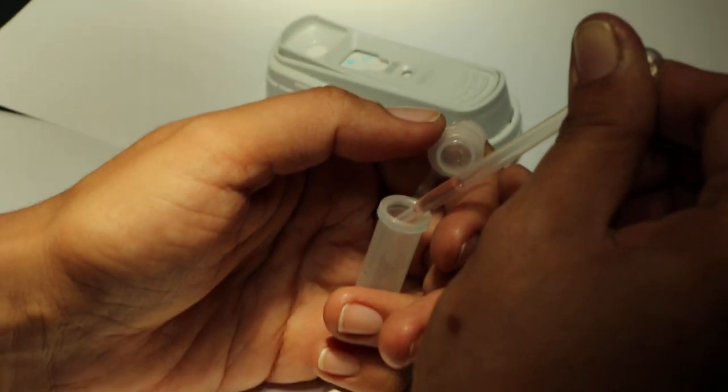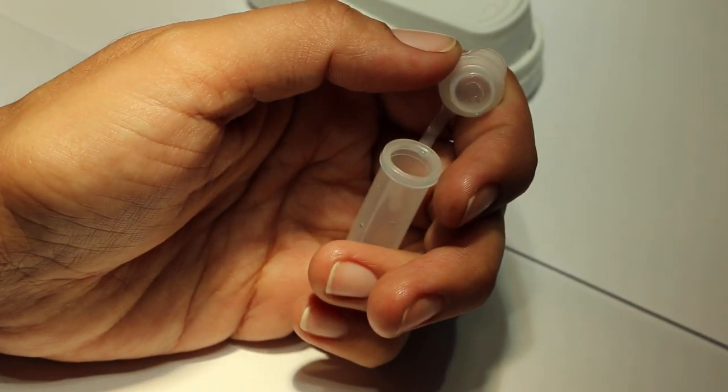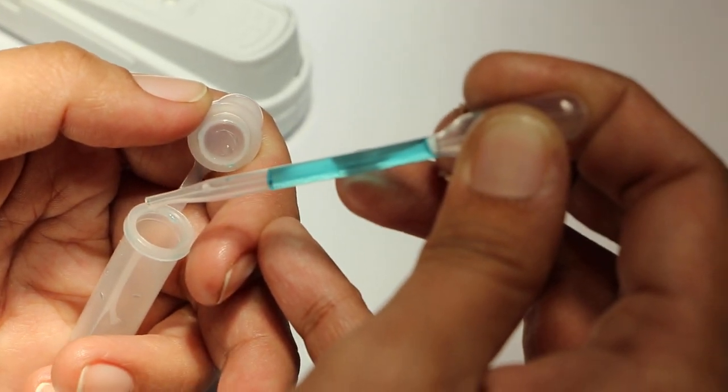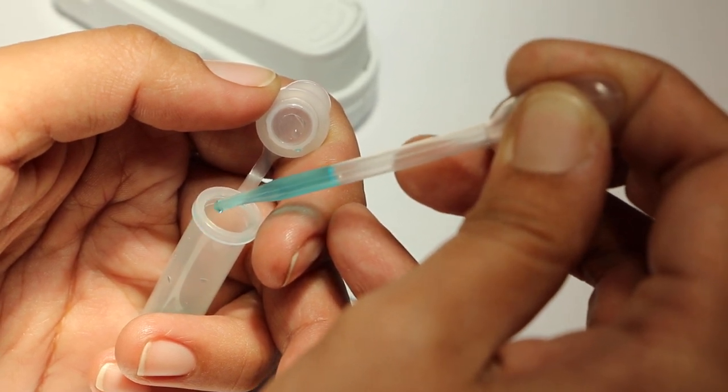So this is the serum. You need to put it in the container where you will be mixing it. Add three drops — one, two, three — from the blue one. Then add four drops in the same container: one, two, three, four. Close it and mix the serum.